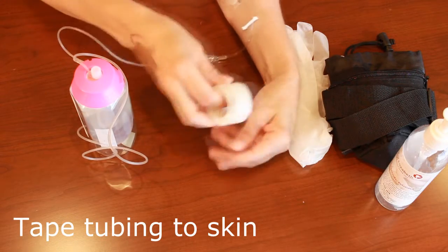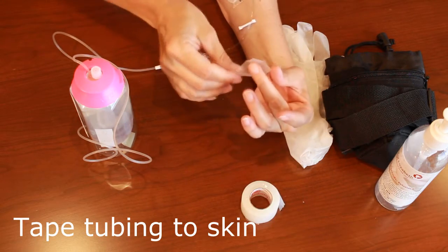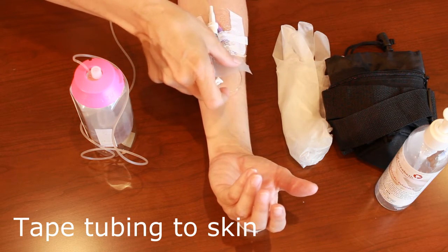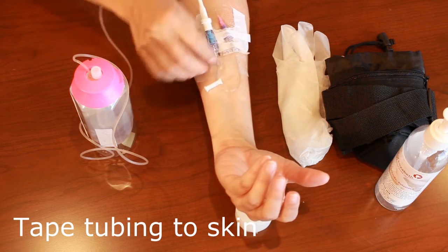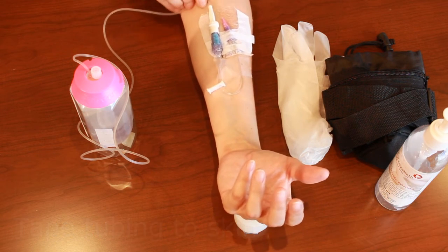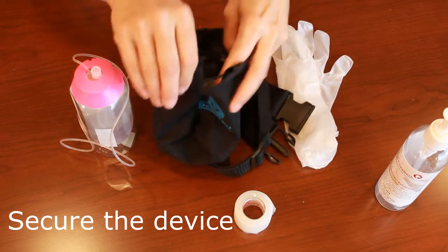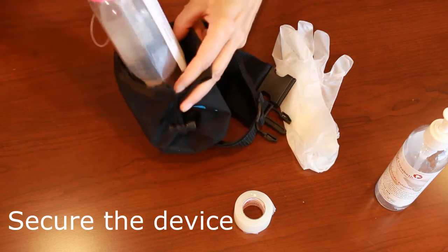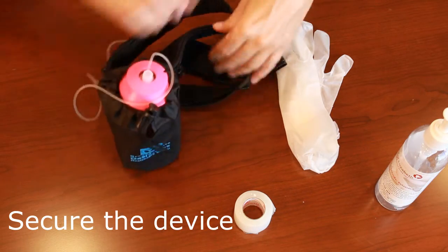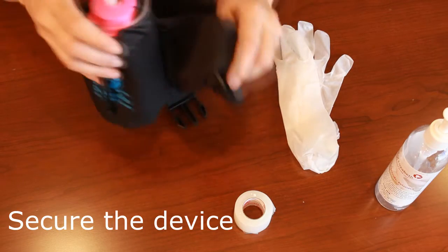You then need to secure the tubing so it doesn't get caught. With a piece of tape, loop up the catheter and place tape — not on your dressing — to secure it in place. You can also put another piece of tape to prevent it from being pulled out. Then simply place the elastomeric device into the waist pouch and secure it to the patient's waist using the belt, or place it on their bed if they're resting, or hang it on the arm of a chair.